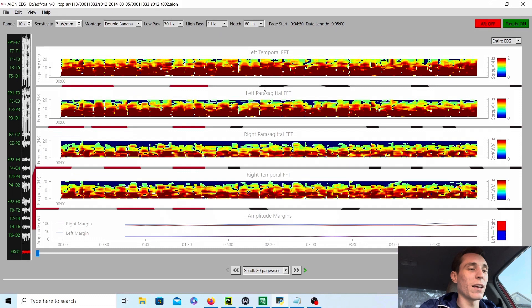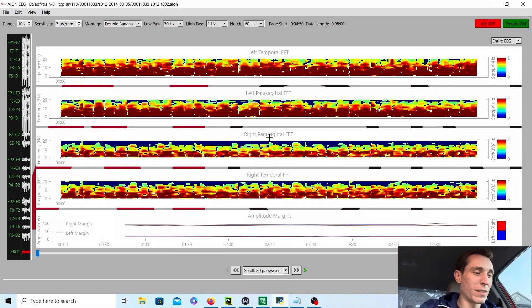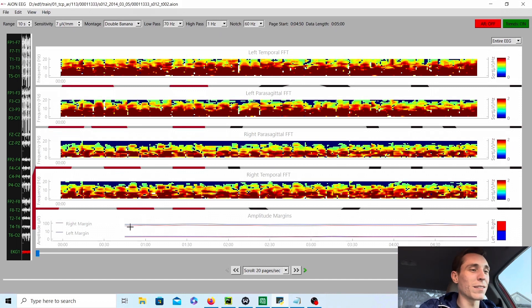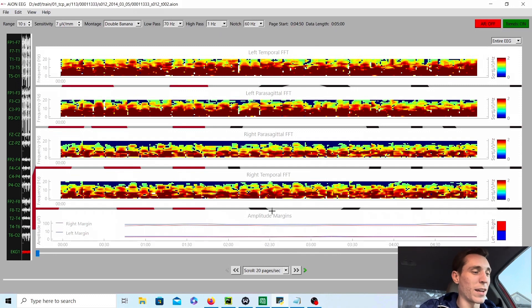You could see the left side — this is what it looks like with the lateralized periodic discharges. And it looks a little bit less active on the right side. This can also be seen in the amplitude, where the left side is the blue line and the right side is the red line. The red line is below the blue line — the blue line is higher. Left side has higher amplitude than the right side because the discharges are happening on the left side.